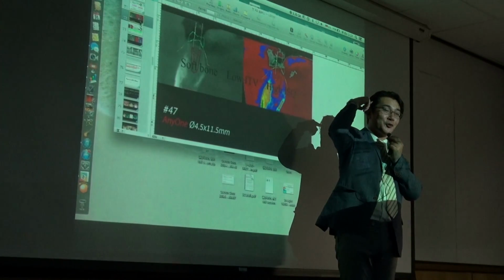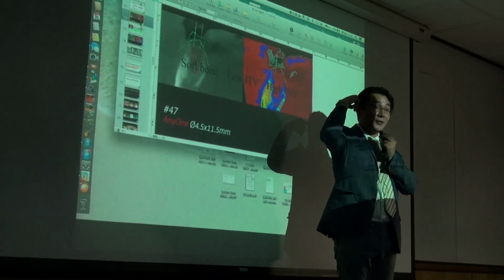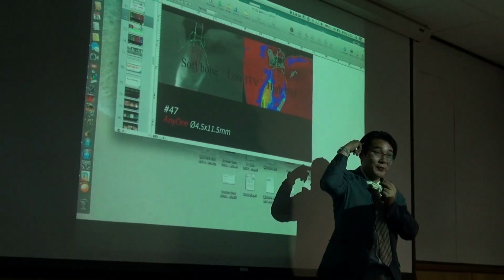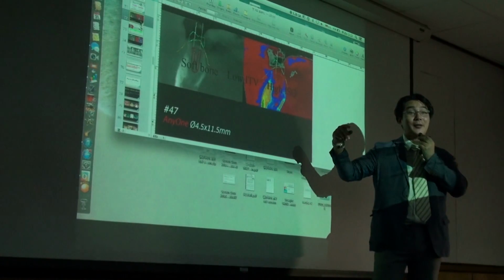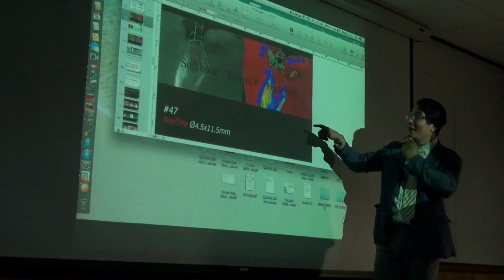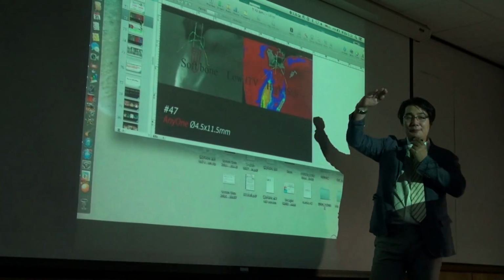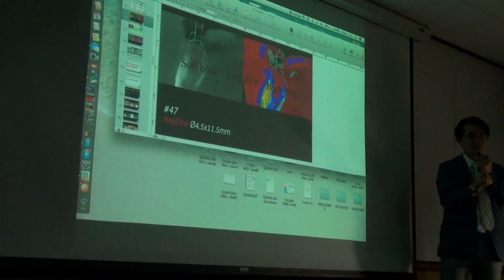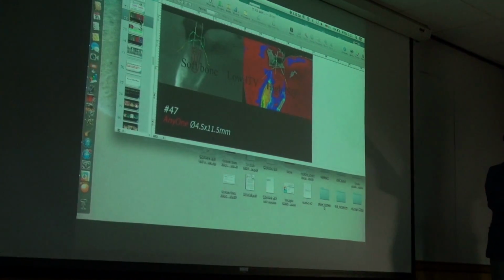If somebody pushes me from this side, my moving degree is higher than if I were short, right? This is the basic logic of ISQ value science. So crestal bone hardness and implant vertical position are closely related to the ISQ values. That's why I cannot believe the ISQ value 100%.